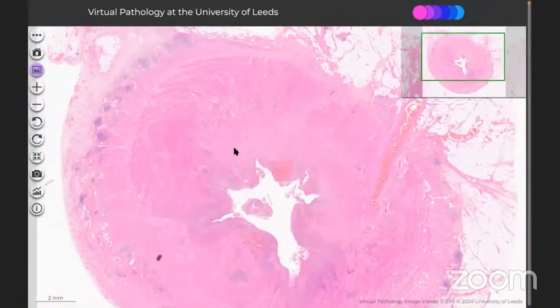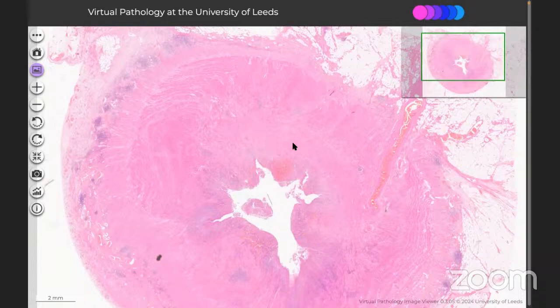So you will correlate with the previous biopsy if there is one. Mostly the patient will have other systemic or GI involvement, like either gastric or esophageal, or the ileal area will be involved.